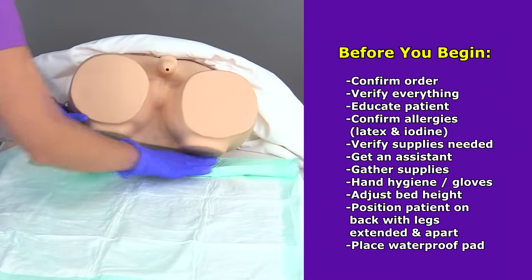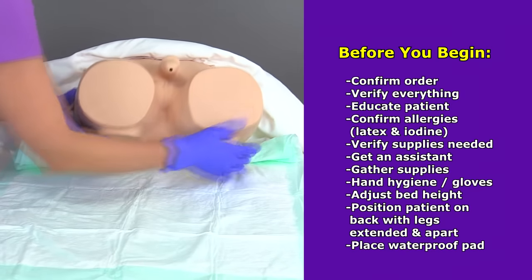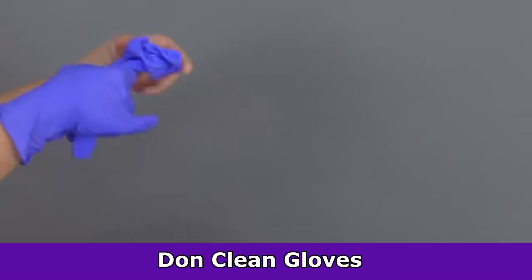During patient positioning, this is a great time to place a waterproof pad under the patient to protect the linen and make cleanup easier. Once you're done with that, doff your gloves, perform hand hygiene again, and don another pair of clean gloves.